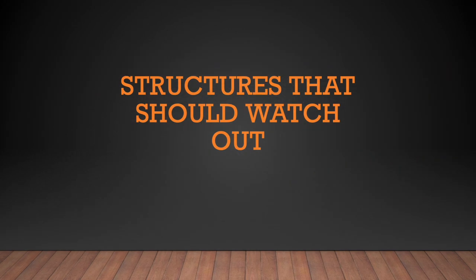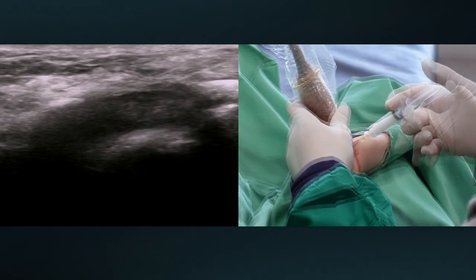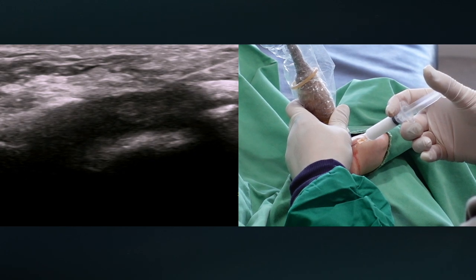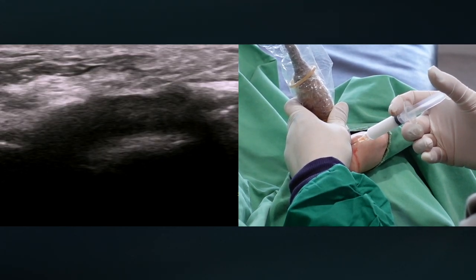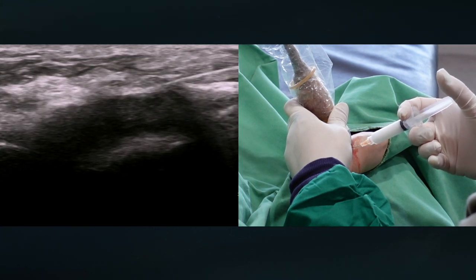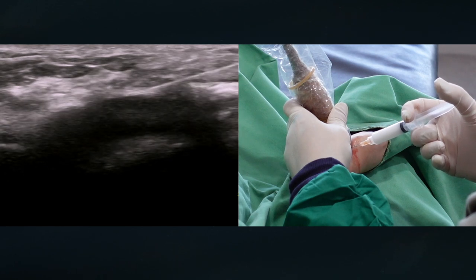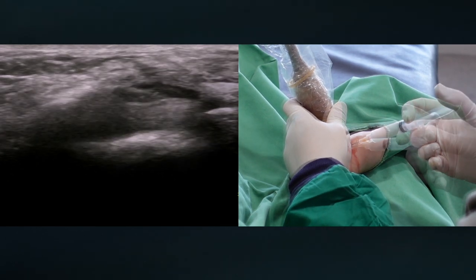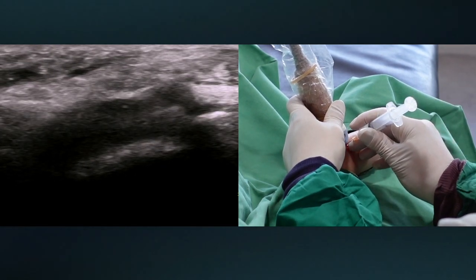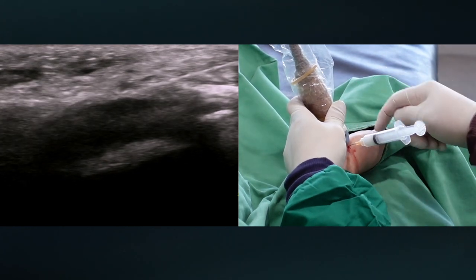Let me explain more about the structures we need to penetrate — lodging the needle tip under the ligament. The median nerve is tightly attached to the transverse carpal ligament, so I am extremely cautious when penetrating the ligament and preparing for an abrupt loss of resistance.